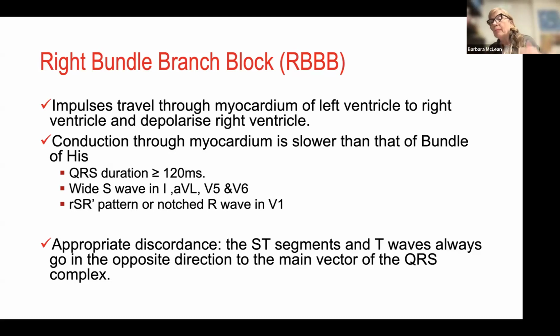So that would be on my limb leads, AVR, AVF, and on my chest leads, V1 and V2, maybe even V3, all current going to the right, meaning upright in AVR, completely abnormal. In AVF, very normal. In V1 and V2, big uprights, totally abnormal.